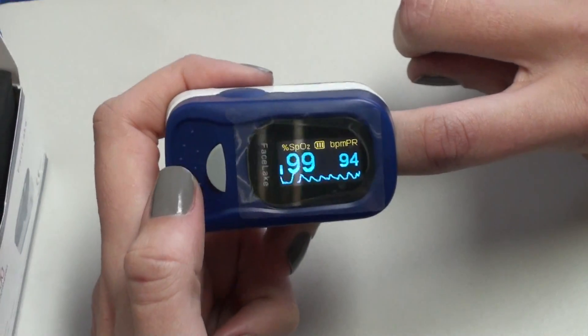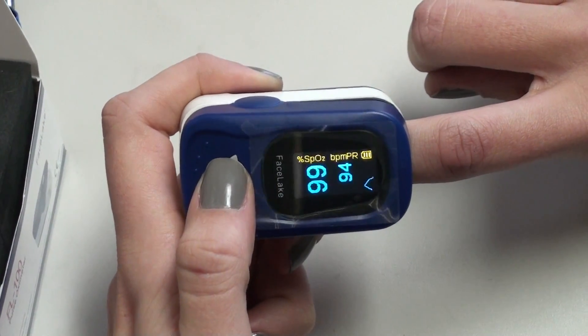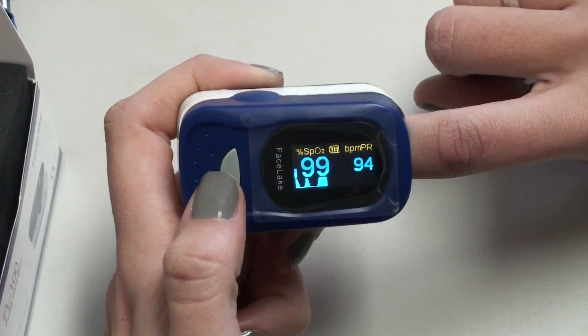Once you have your reading, you can click several times and you'll see the four different display modes for easy readings.